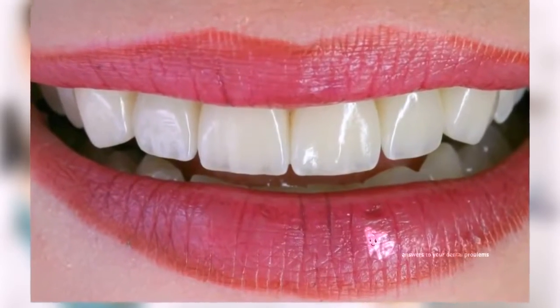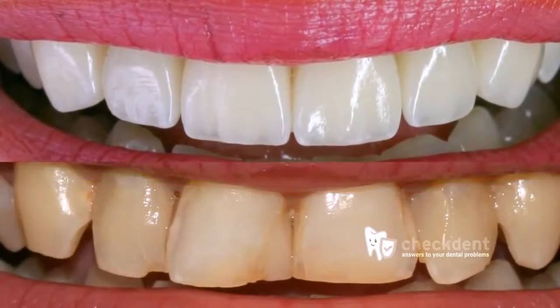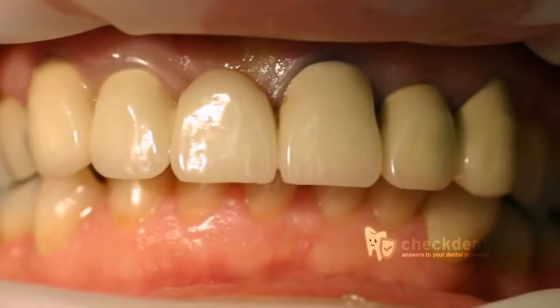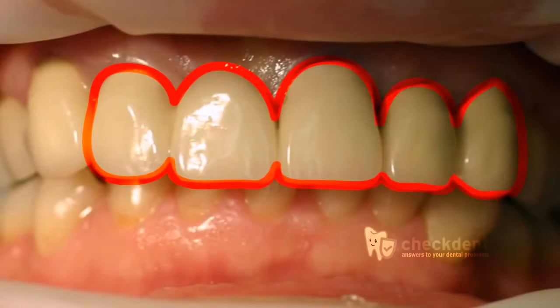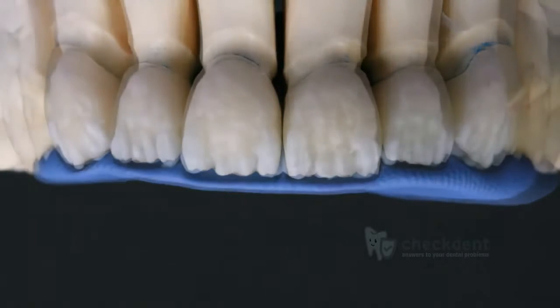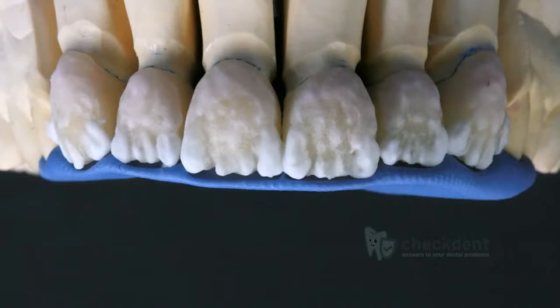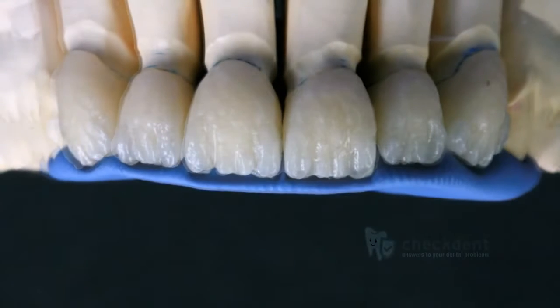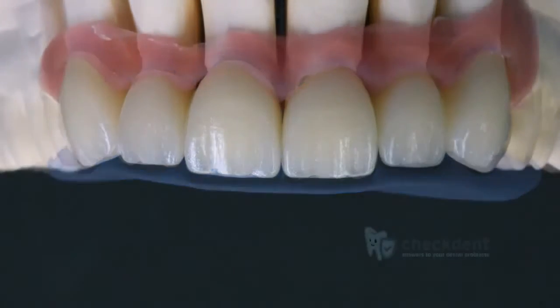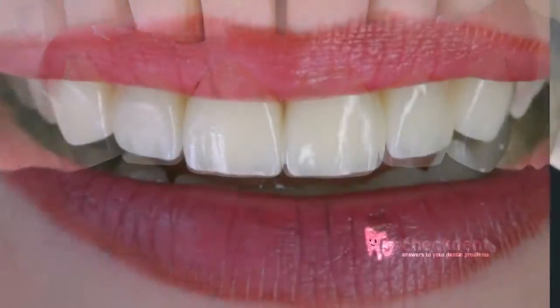This picture illustrates an aesthetically pleasing crown, which is not identifiable unless pointed out. This picture illustrates crowns on the upper teeth, which can be distinguished right away as artificial. Here's the difference between the two. In the first picture, the ceramic has been coated, which means that the patient sat by the dental technician, who laboriously painted onto the ceramic layer after layer until it matched the original teeth. The translucent effect of the tooth can thus be recreated.